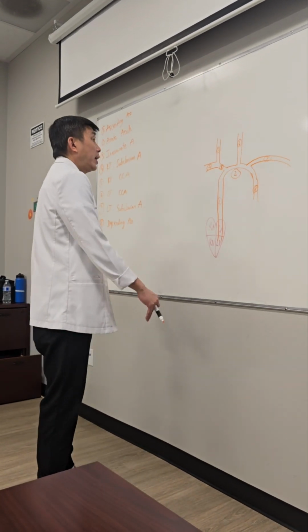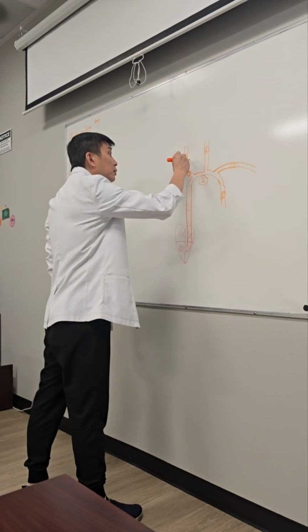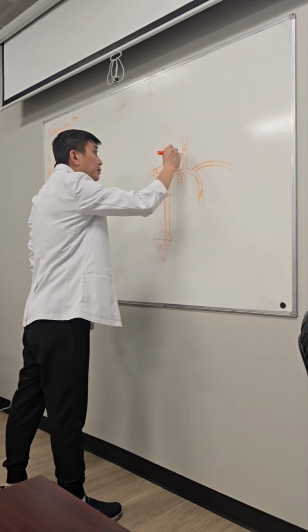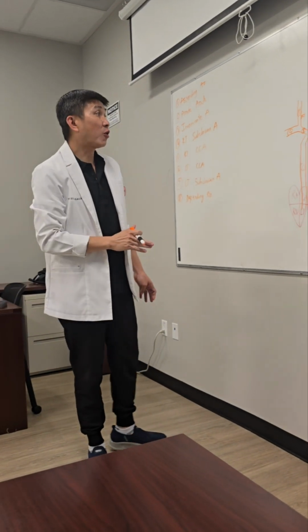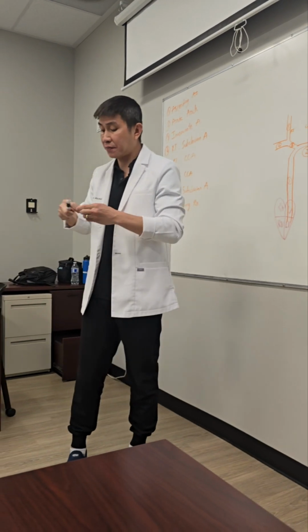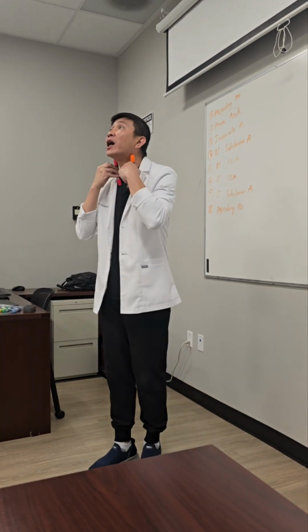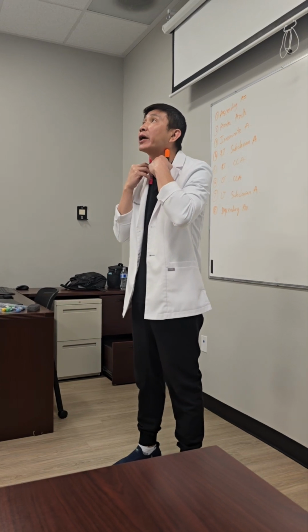Okay? And now, from the right and left CCA, you have it. Right and left CCA run on each side of your neck.